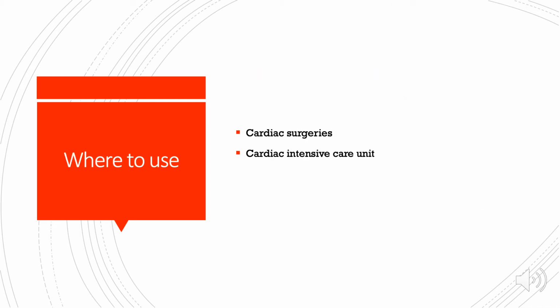So where to use? I found this question a little bit difficult just because I don't see them clinically used. However, I would say that anything cardiac would be a useful place to have both of these methods used. So intraoperatively in any cardiac surgery, or postoperatively in the cardiac intensive care unit.